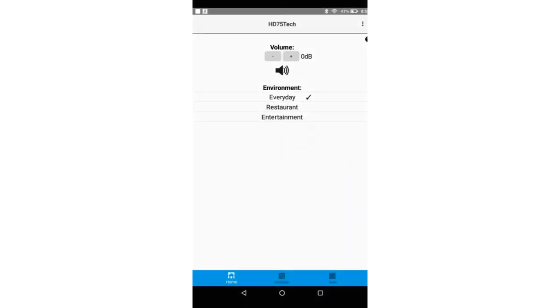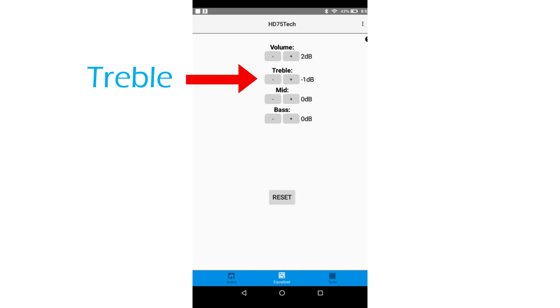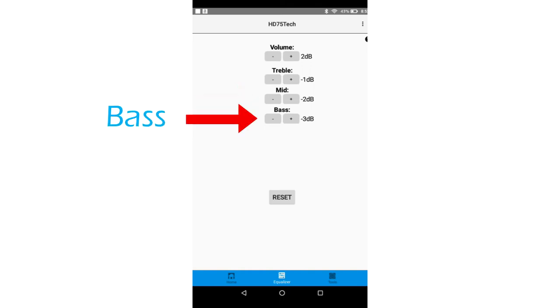Equalizer: the equalizer is where you can adjust the overall sound of the HD75. Ask the patient how the HD75 sounds and adjust accordingly. Adjust the volume level up or down to increase or decrease the overall frequency response. Treble provides clarity of speech — to increase clarity, increase treble. If the patient is experiencing a tinny sound and/or some feedback, try to decrease treble. Decrease mid frequencies if you are hearing a robotic sound when people talk. Increase mid frequencies for more volume. Bass provides low frequency amplification — if your own voice is too boomy, decrease the bass in small increments. If you just need to boost volume a bit without increasing the high frequencies, try increasing bass in small increments. If you adjust the equalizer and it does not sound good, tap the reset button to bring values back to the starting point — all zeros.